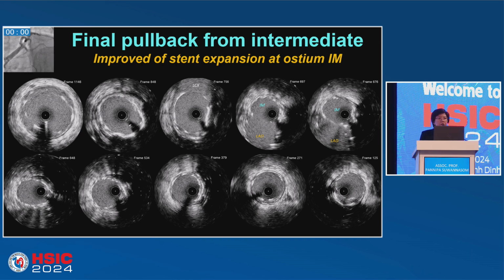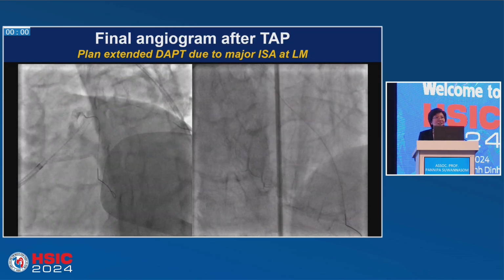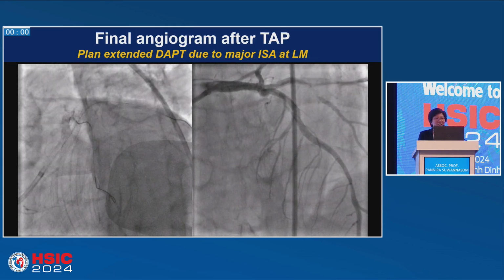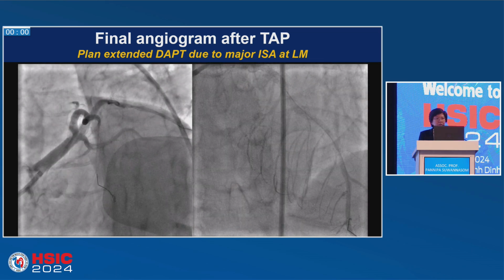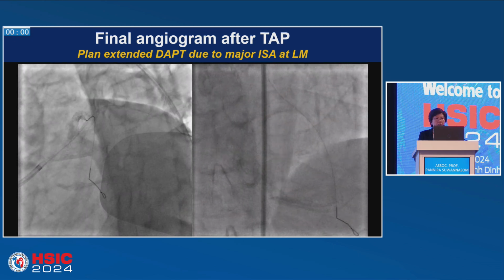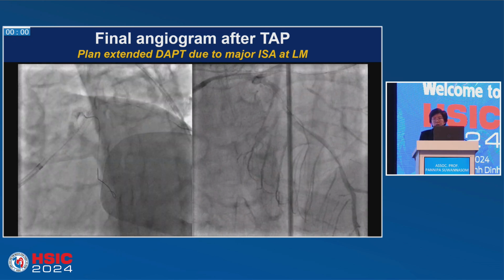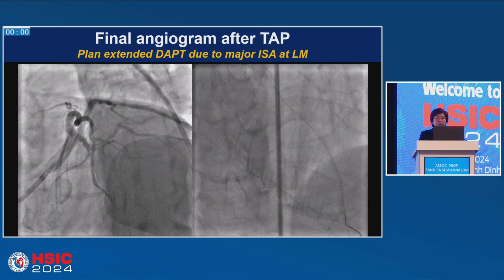It's like 6.0, and we do not have a balloon bigger like that, especially since the stent that we implant is just 4.0. I think there is no stent in this world that can go to 6.0 for the time being. So in this patient, because the strut is floating in the left main, I think the patient should be on extended dual antiplatelet therapy, at least, if allowed, about 24 months.